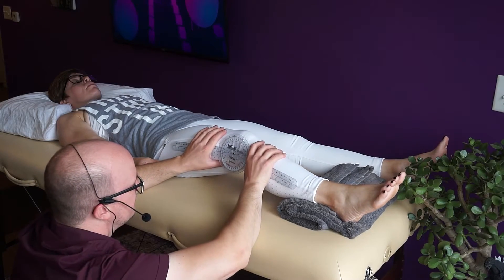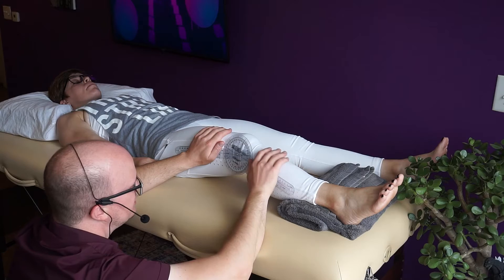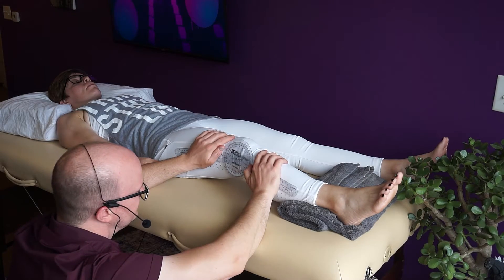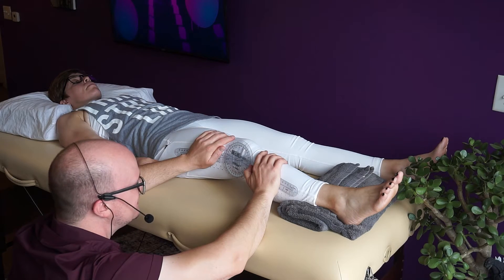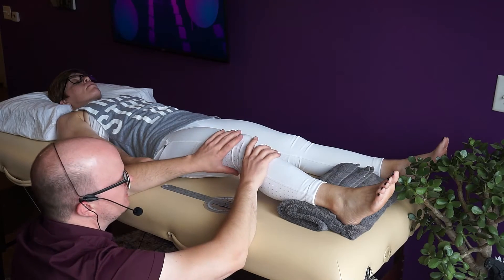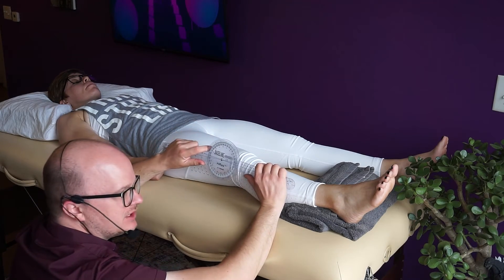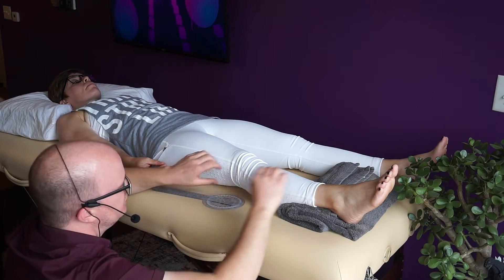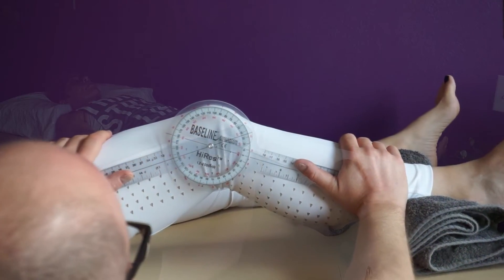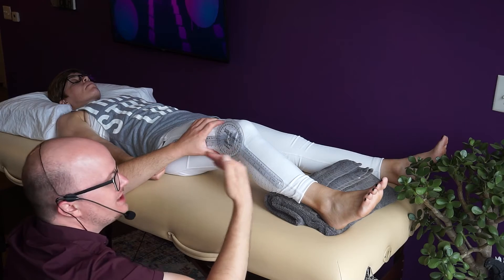Now let's imagine she's tight — she's had a knee replacement. On the goniometer, she is lacking 21 degrees of knee extension. I have her push down — she's lacking 20 degrees actively. I push passively — it feels stretchy — now she's lacking 16 degrees of knee extension. If she starts with 42 degrees lacking and we push down and she's still lacking 35 degrees, it's not about how much she moved through — it's about how much is available or not available at that joint.